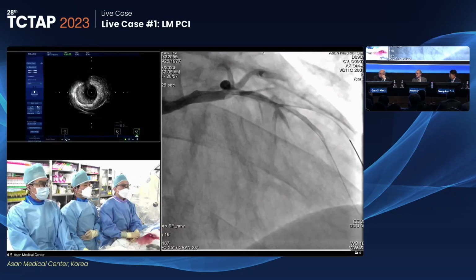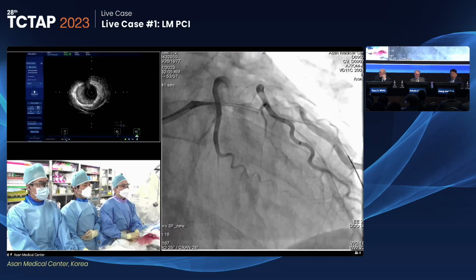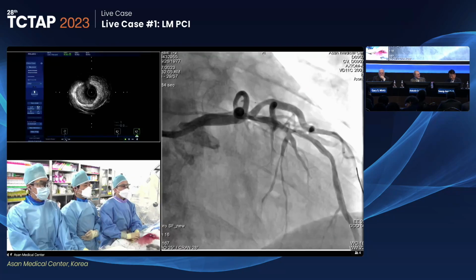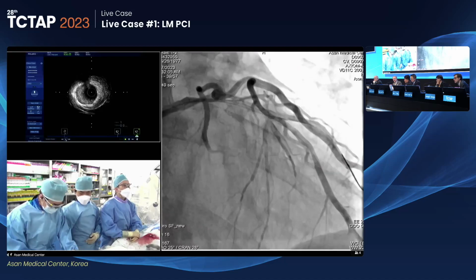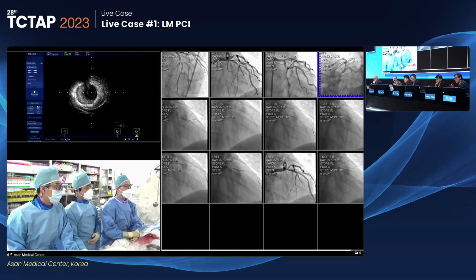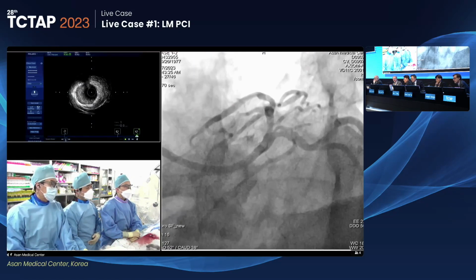I actually think there's room in the ostium of the LAD. Well, there is room, but there's a lot of overlap also, so I don't know how well they can police that. Well, we need a spider view here. Spider view actually is pretty good, George. Spider view, please. Perhaps they can put the wire of the diagonal into the circle, that might help.